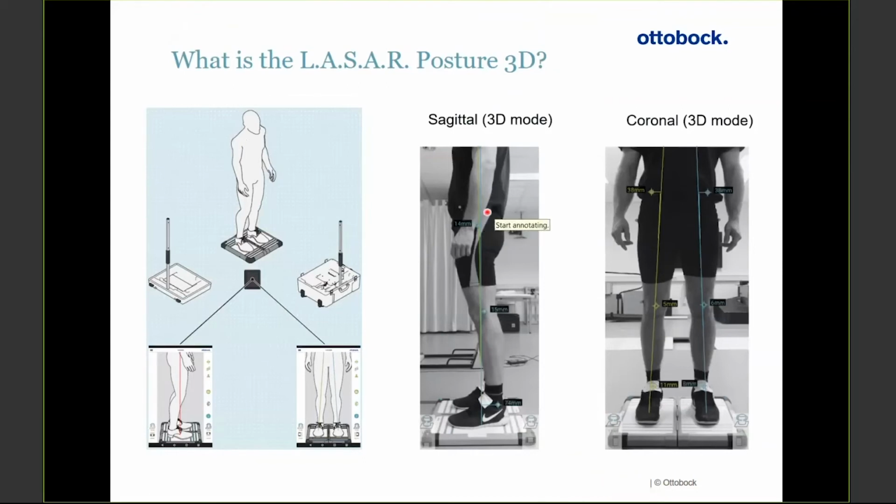So even though that's a very typical non-involved patient or person, you can see that the laser posture tells us quite a bit with the vectors, right? It's not just the center of pressure, just to reinforce what you said. Exactly, yeah.